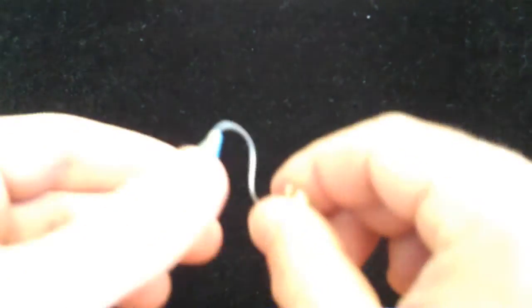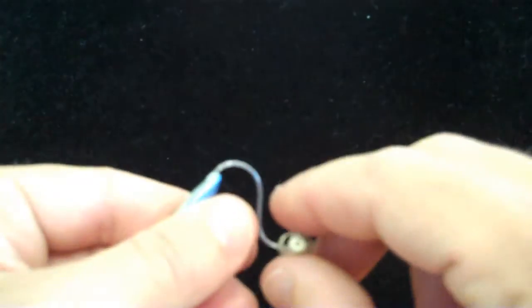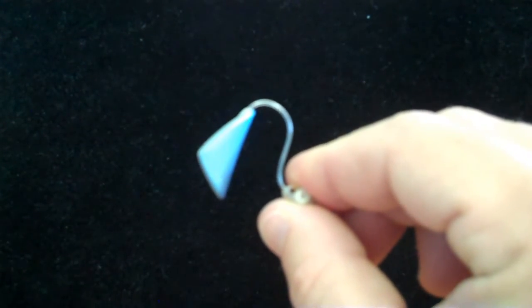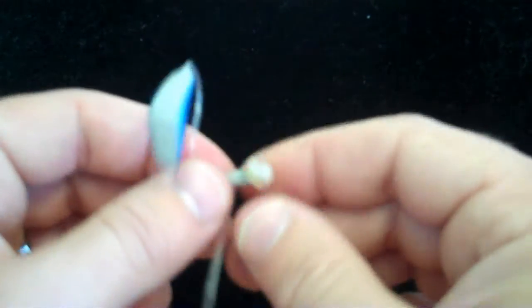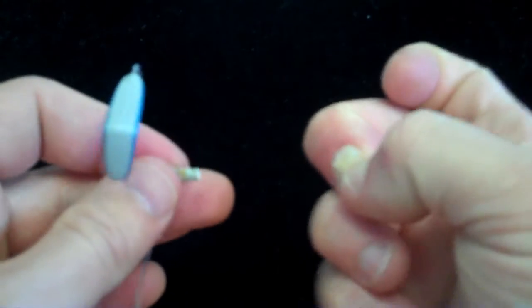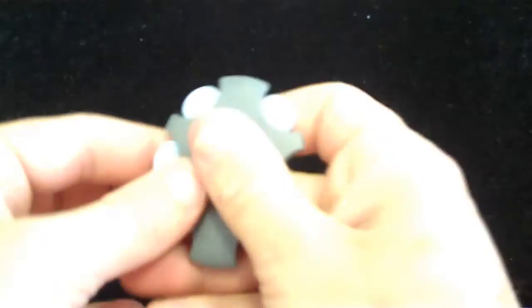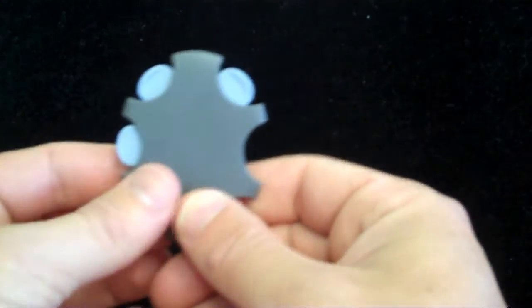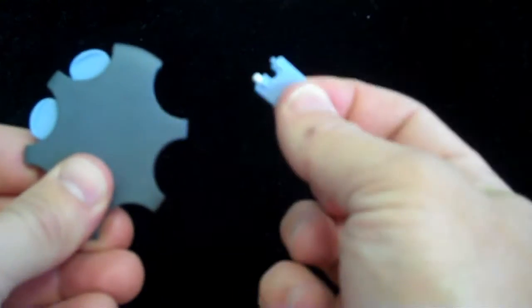A similar arrangement from another receiver in the ear style hearing aid is this one right here from another hearing aid company called Oticon. Once again, non-custom dome on the end. We pinch just the very tip and remove. The new filters in this case come in a case just like this. We remove one of the tools, just like the Phonak product.